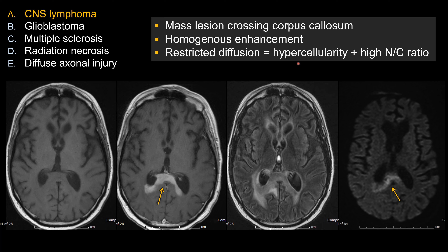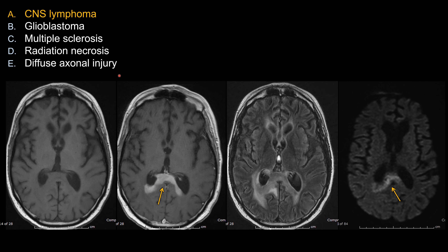Combining all the findings, choice A is the best answer. When you see a mass lesion crossing the corpus callosum, you should think about CNS lymphoma, high-grade glioma, or tumefactive lesion — tumefactive MS.